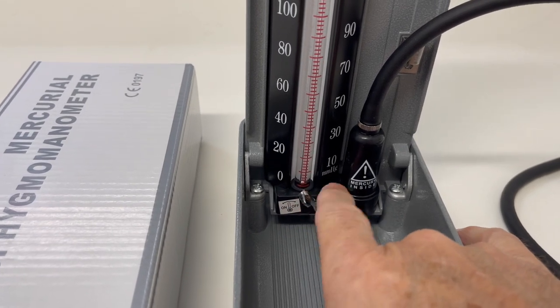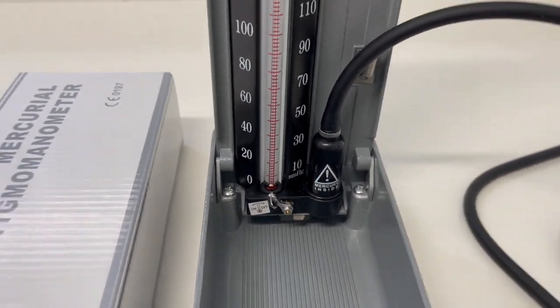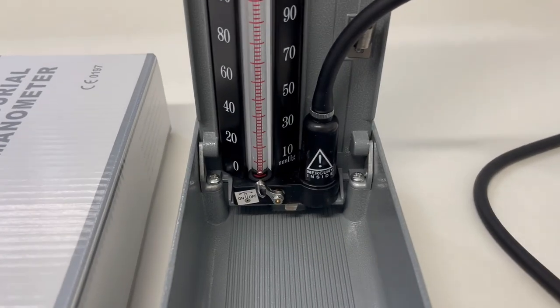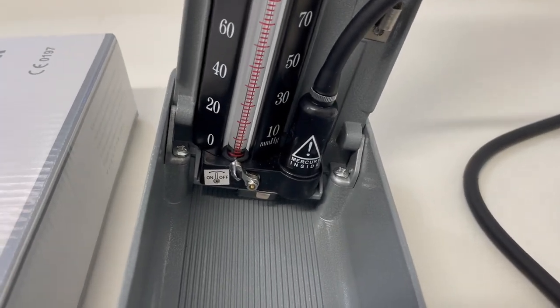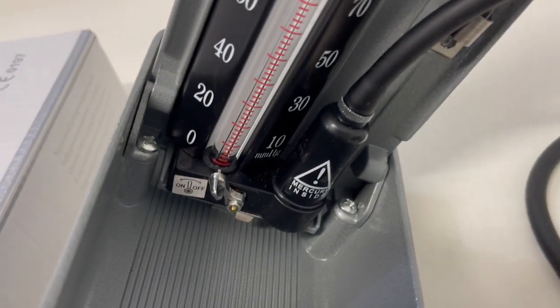You leave this tap open, you turn the whole device over to the right. You'll see the mercury will drop below the zero and you won't see it at all.